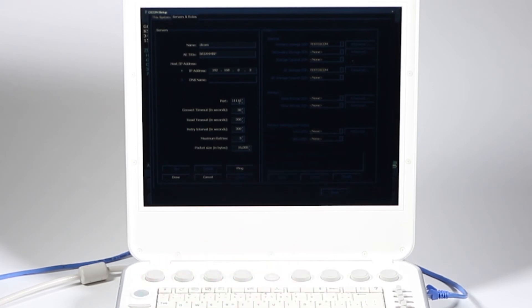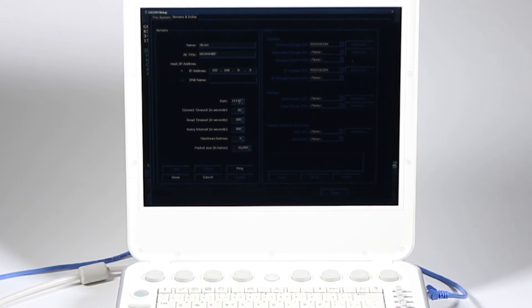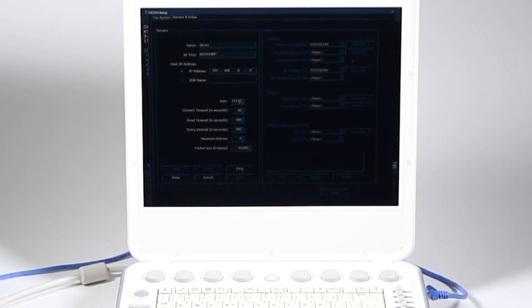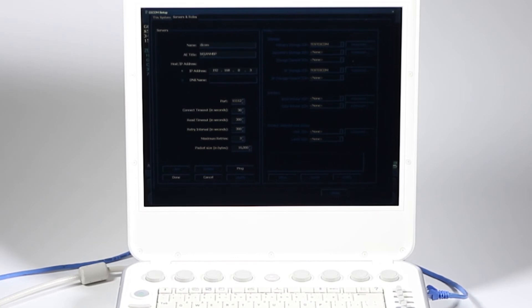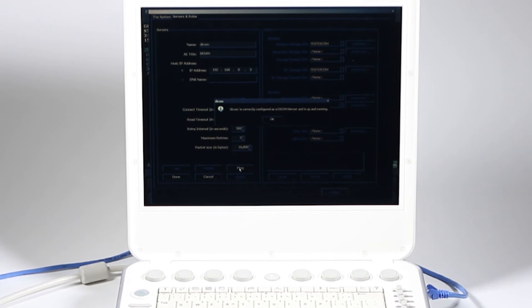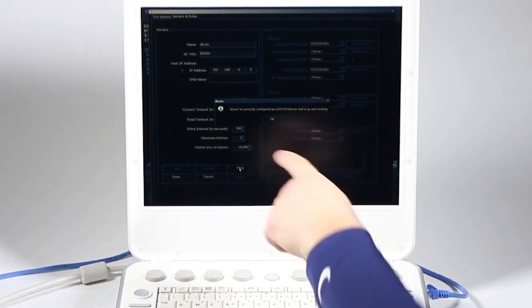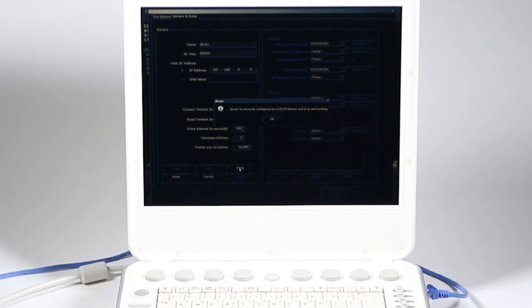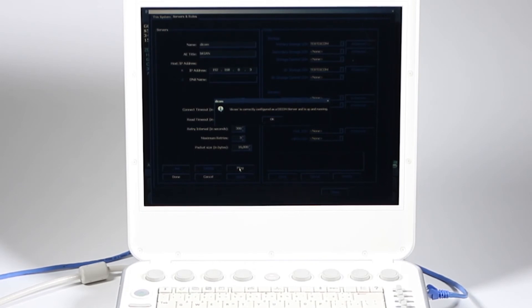My DICOM server, which is sitting right next to me, has the port number of 11112. Yours won't be this unless you're using a Macintosh software called Horos. Otherwise, they'll give you something different. So now I've got this all set up. I've got my AE title, all that stuff. I can go ahead and hit ping. And it says DICOM is configured correctly as DICOM server and is up and running. So I've connected to my DICOM server and I'm ready to go.